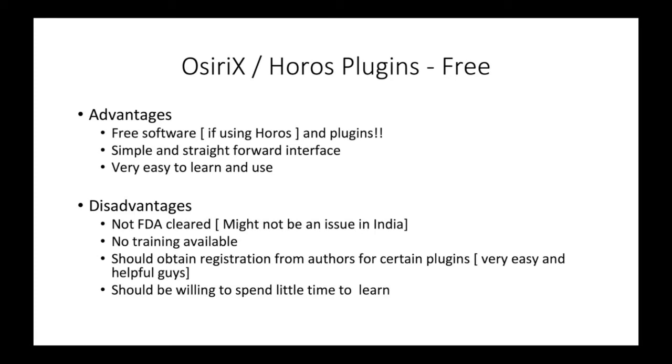Disadvantages being they are not FDA cleared, but if you are staying in India and using it in India, that should not be an issue. There is no training available whatsoever. You have to learn on your own from small tutorials available on the web pages which I showed you. And you should obtain registration from authors for certain plugins like CMR Sec Tools.